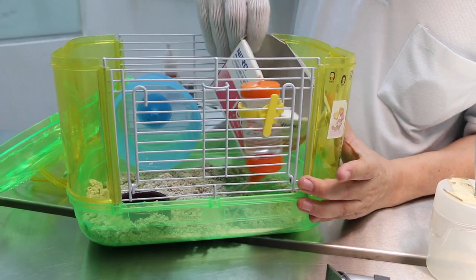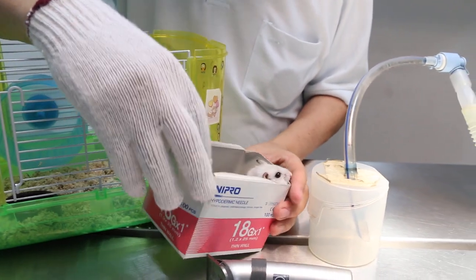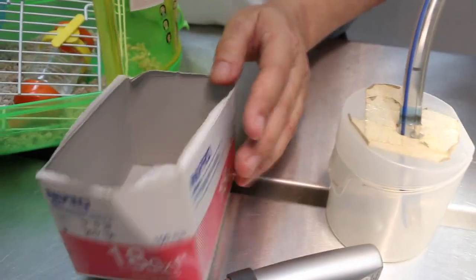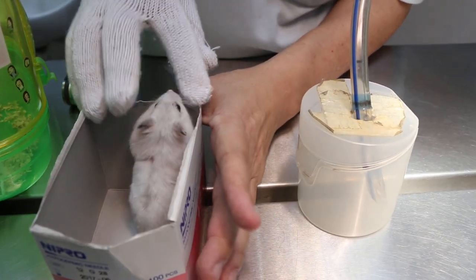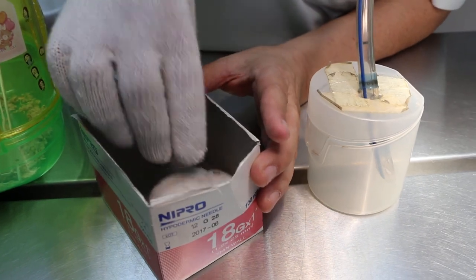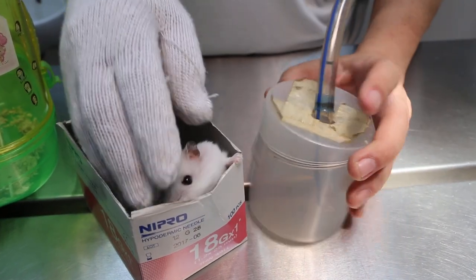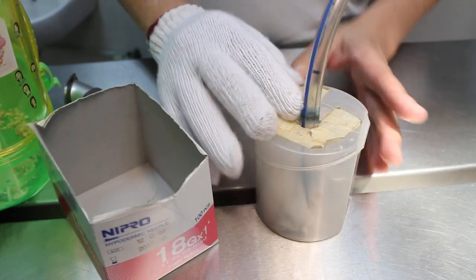To prevent myself from being bitten, and as you can see the wound is here — there is a wound here — I need to shave it. I need to put some gas in, otherwise he will not like it. Now, wear gloves. Wear gloves, but this hamster still bites, so I put it inside here to put the gas.